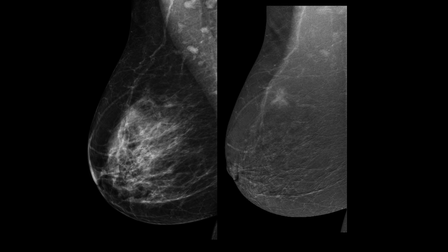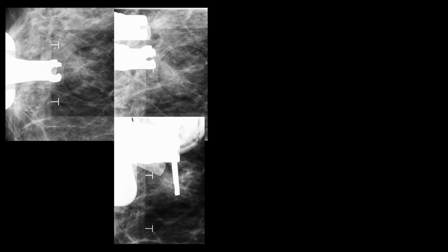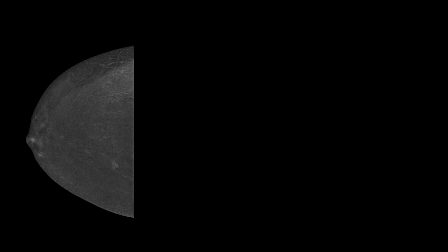There are some classifications, or in this case, where there is non-mass enhancement, there is a bit of asymmetry with some distortion. This was before contrast-enhanced mammographic guided biopsy was introduced. So for that, we took the patient for standard stereotactic guided biopsy. We didn't have tomobiopsy at that time, so we still managed to solve everything. Vertical approach, under standard stereotactic guided biopsy, tissue marker, and then we can confirm, sorry, I don't have the other view, but we confirm that, and this was DCIS, by the way.